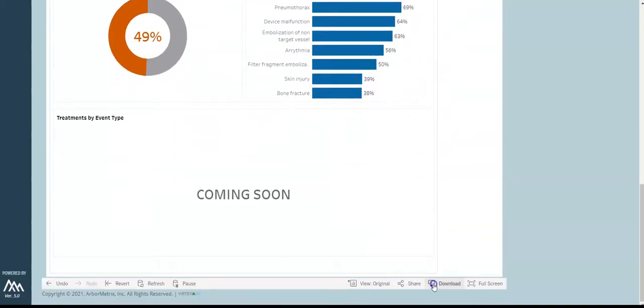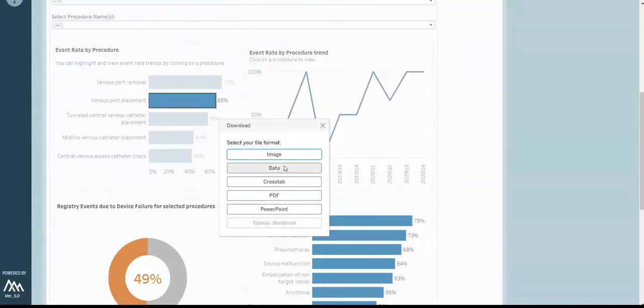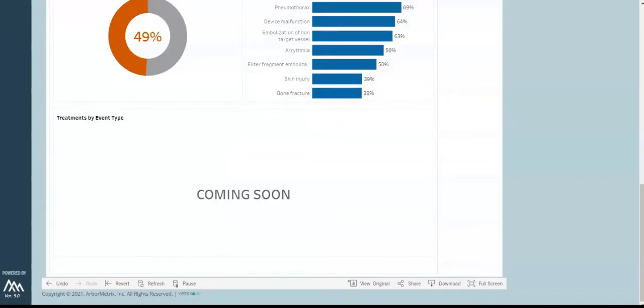Lastly, you can export the data shown here in a variety of formats using the download button on the bottom of the screen.